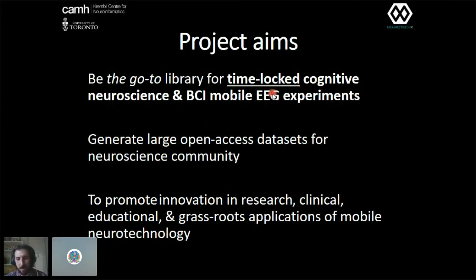That combination of the mobile data streaming, the recording, and the synchronizing to triggers that tell you when events are happening in a stimulus stream, that's really what we're focusing on, because there are additional technical features or challenges that need to be addressed in that, and that's our niche, if you like.